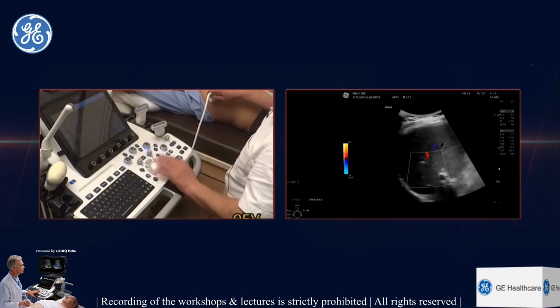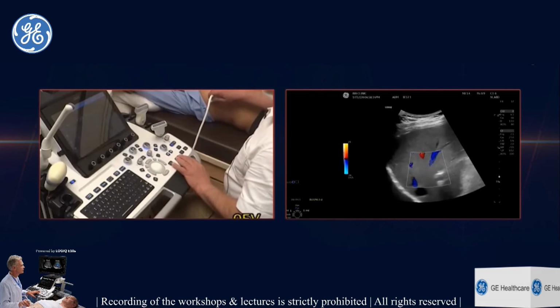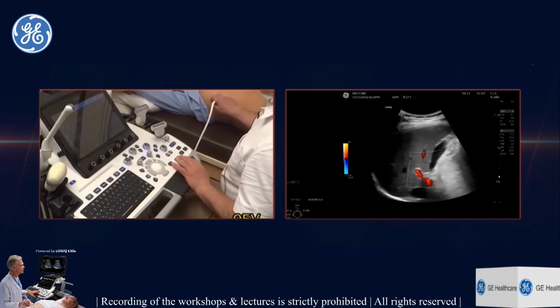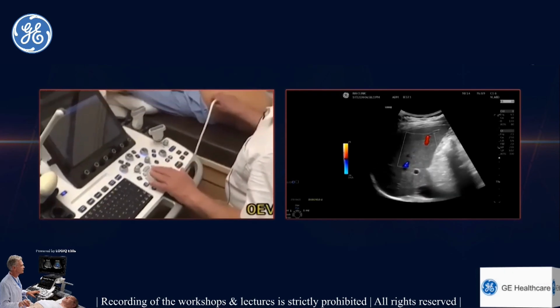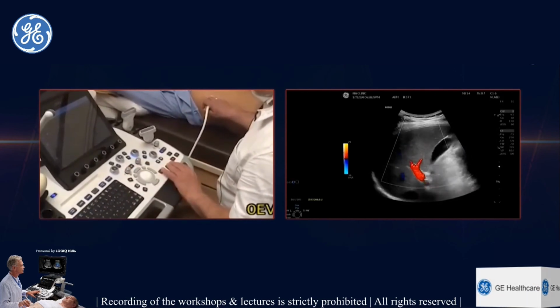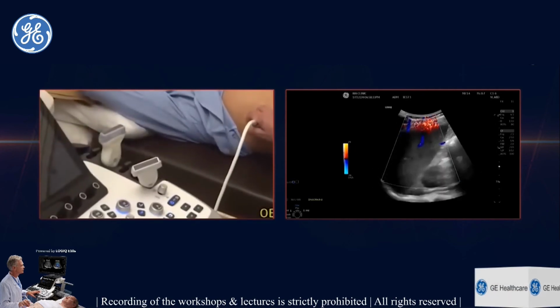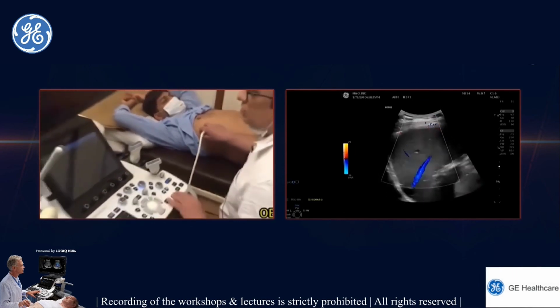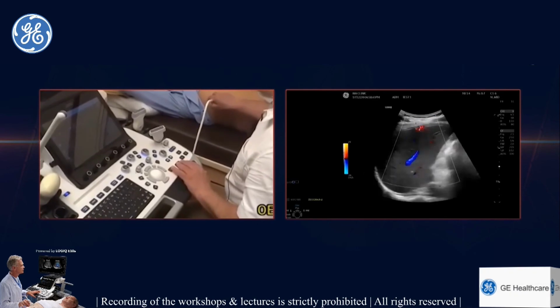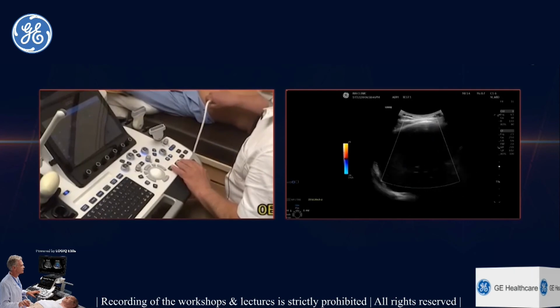So usually when we do liver analysis, we start with color Doppler, and we look at all the normal vascular pattern of the liver to see whether there's any portal hypertension or any other vascular problem. Most of the patients where we do liver elastography will usually be patients with fatty liver or early liver disease where we want to see is there any fibrosis. So that's the hepatic veins here. We are seeing with radiant flow, which gives a 3D kind of cast-like image of the blood flow.